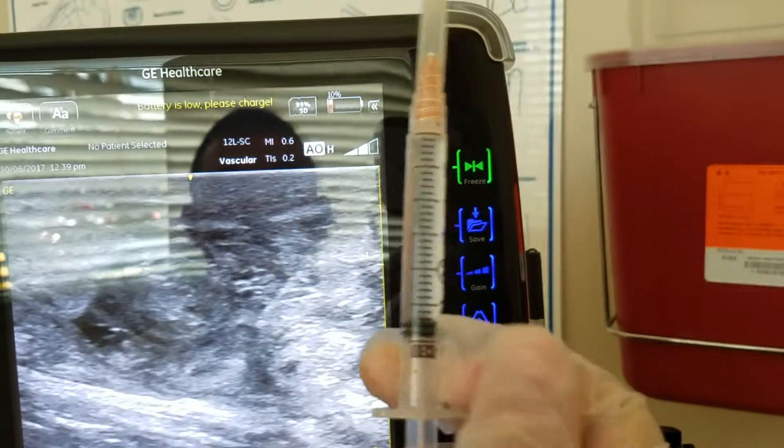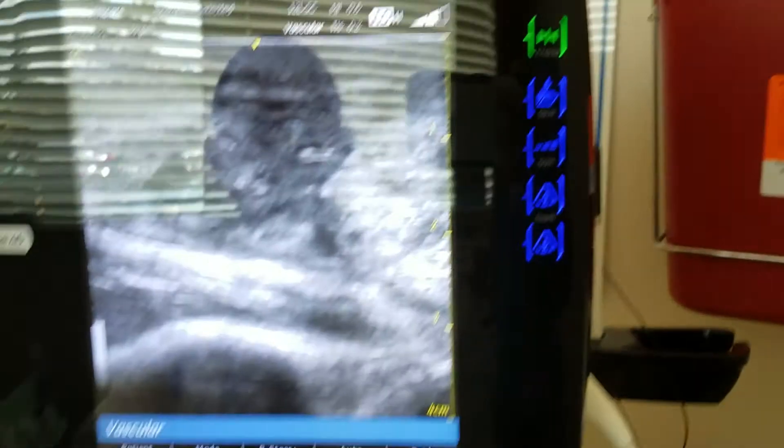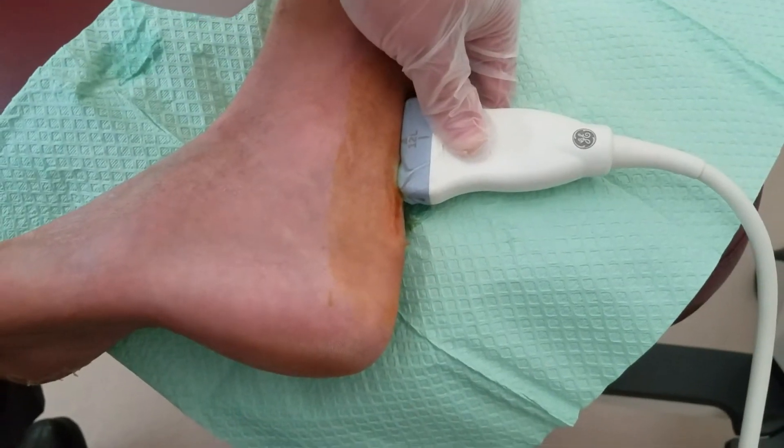Three cc's of stem cell right here — three cc's. That is all amniotic injectable stem cell. We're going to visit the Achilles — that's exactly where it was, the pointer where I showed you on the screen.